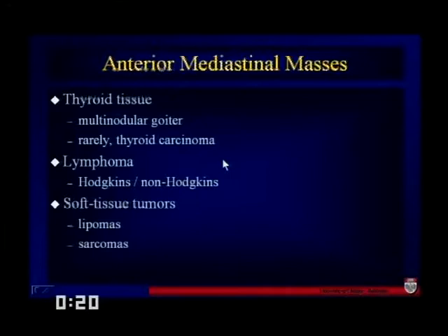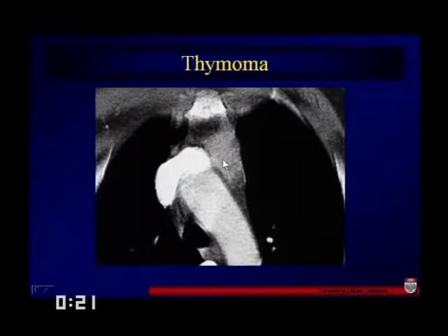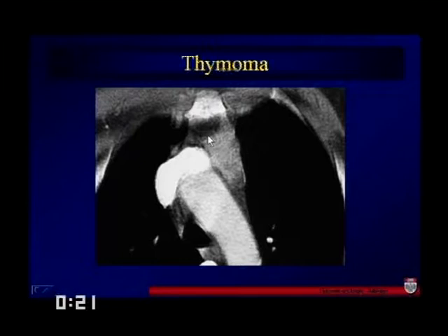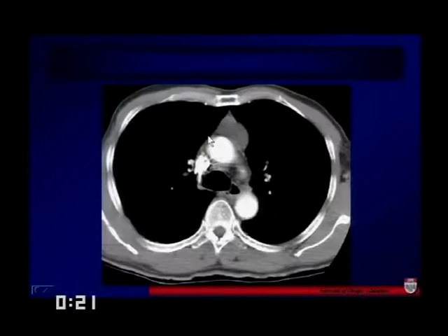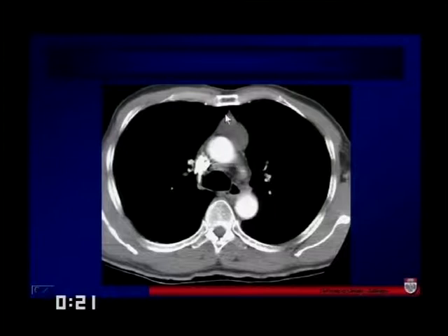This is a case of a thymoma — not real large, but you can see the borders are no longer concave relative to the adjacent lung. This is also a little lower than one might expect for a thymoma. This is another case of a thymoma where the real telling factor is that we've lost the concave aspect relative to the lung — we've actually got convex, somewhat lobulated borders. So these are two cases of thymoma.